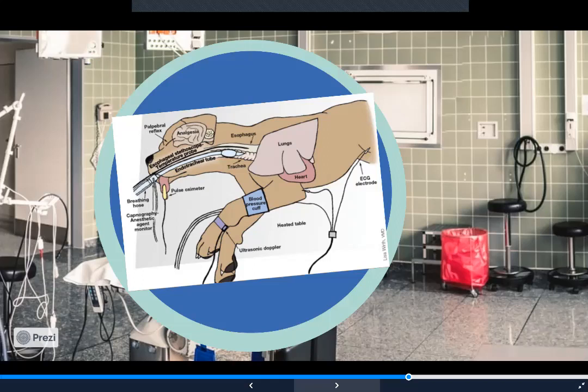So it's important that we have a monitoring device to be able to listen to the heart. Best practice is to have a device where we can actually hear the heart rather than just relying on machines. As you know, we could just have our ECG leads on a table at times and it will read a false signal saying that there's a heart rate. So we can't always rely just on machines.